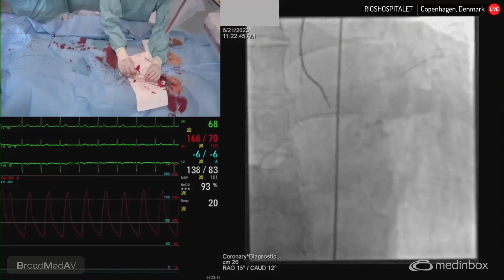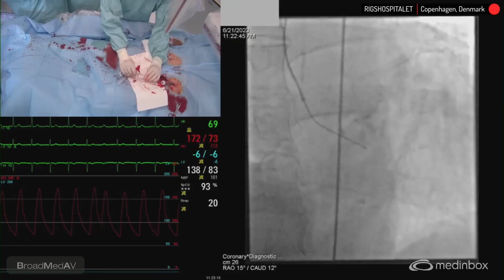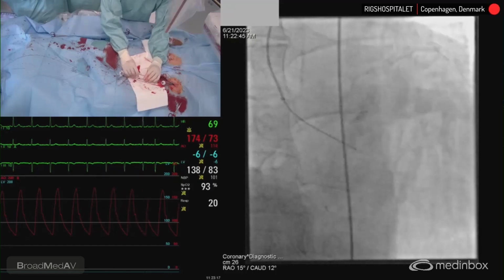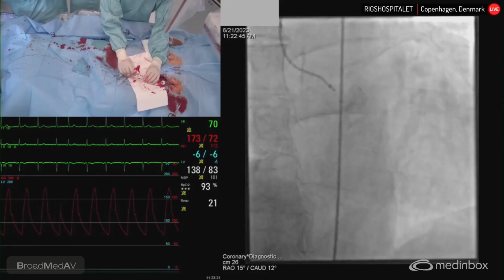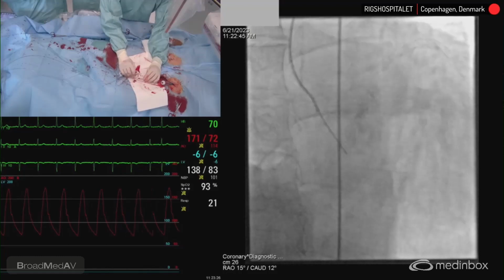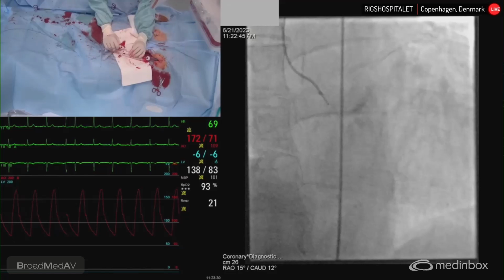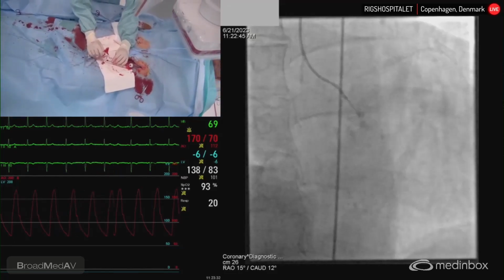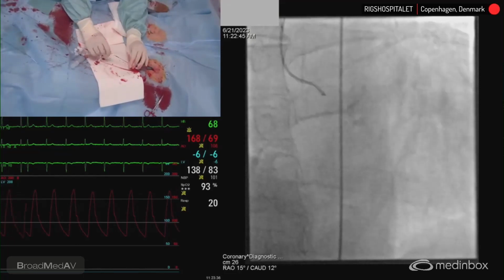That's the tightness there. I think that's the non-coronary cusp. So that's just to, I know there's no pigtail in, but you get the feeling. I think you have to come a bit, yeah, very close to it. Maybe it doesn't look the smallest anatomy indeed. Probably have to come a tiny bit closer to the anatomy, maybe.